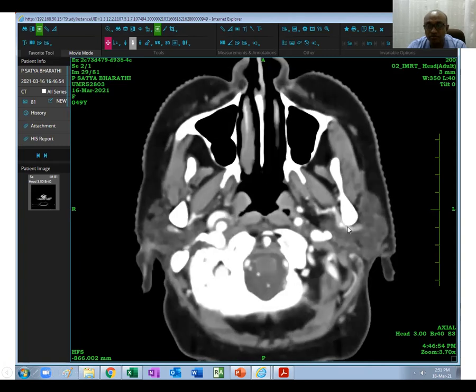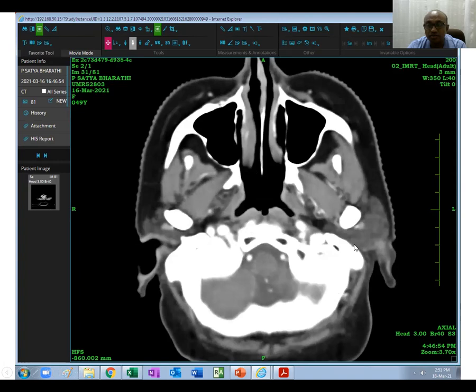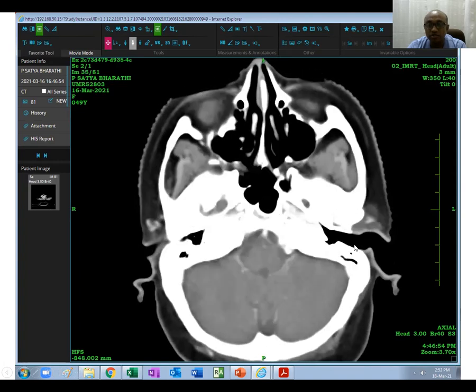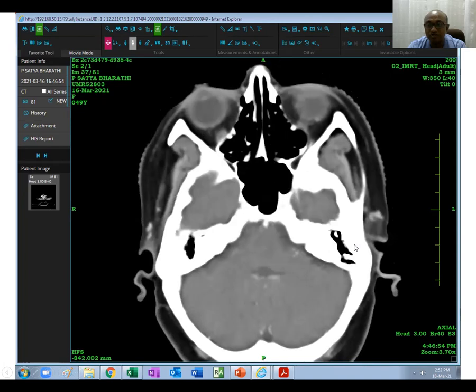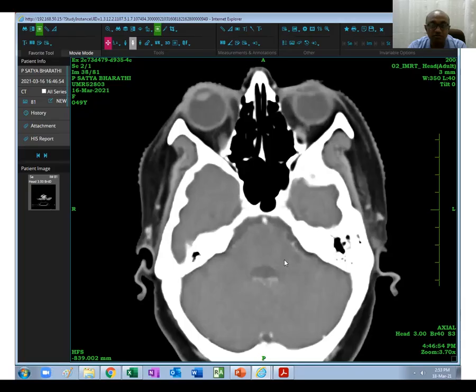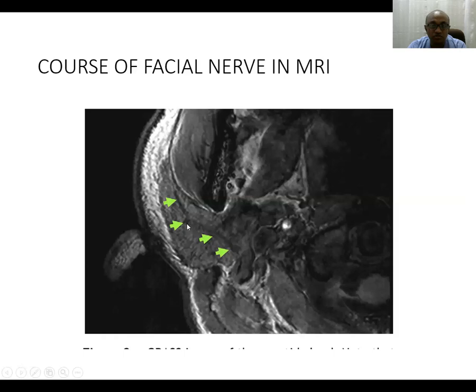We cannot see the facial nerve here properly on CT. For that reason, we have to see the MRI. Without MRI, seeing the facial nerve is very difficult. You can see only the course of the facial nerve — a very superficial part of the nerve. That is all about the parotid gland anatomy as well as its contents. Thank you very much.